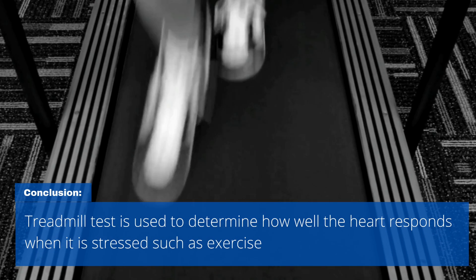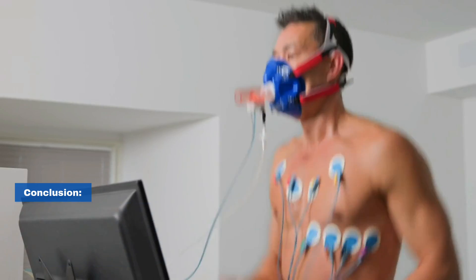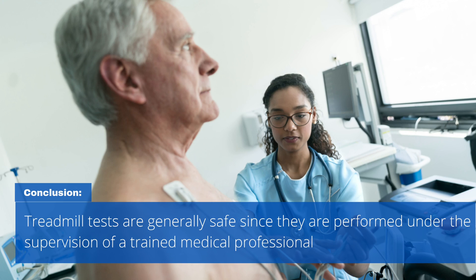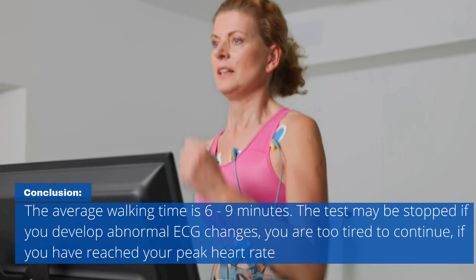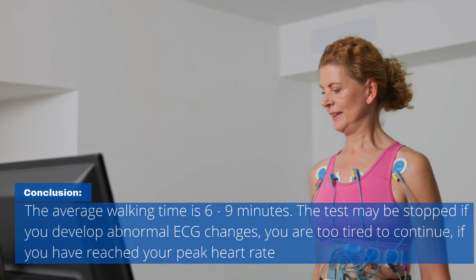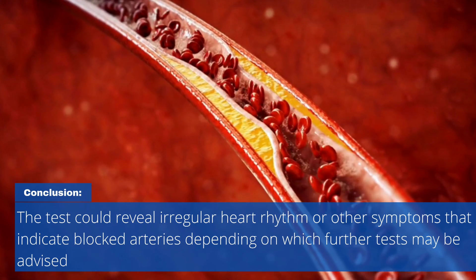Treadmill test is used to determine how well the heart responds when it is stressed, such as during exercise, and is advised for people with chest pain or with symptoms of coronary heart disease. Treadmill tests are generally safe since they are performed under the supervision of a trained medical professional. The average walking time is 6 to 9 minutes. The test may be stopped if you develop abnormal ECG changes, are too tired to continue, or have reached your peak heart rate. The test could reveal irregular heart rhythm or other symptoms that indicate blocked arteries, depending on which further tests may be advised.